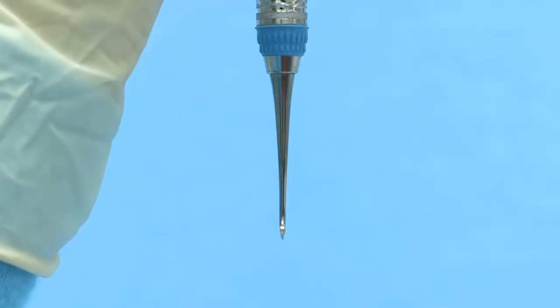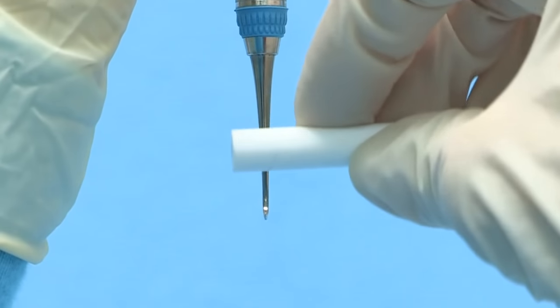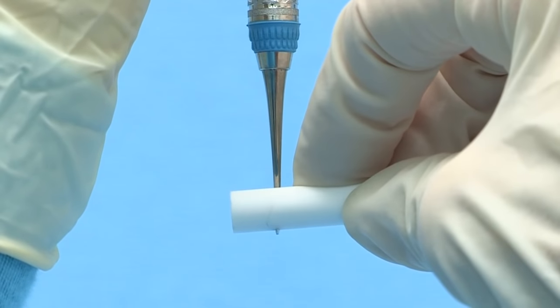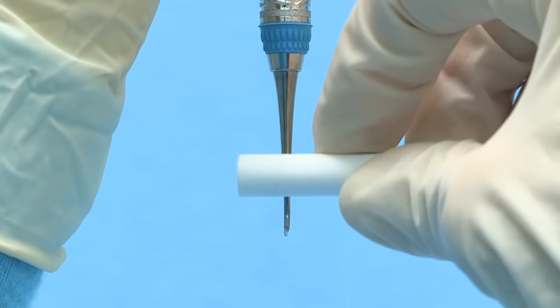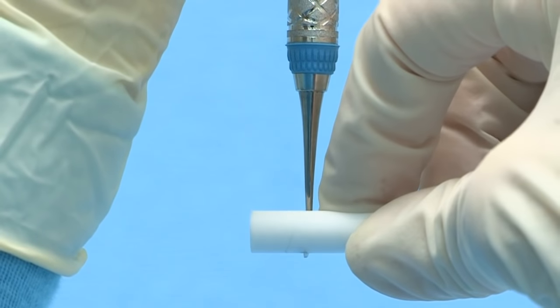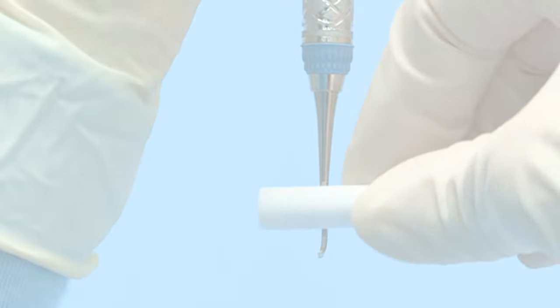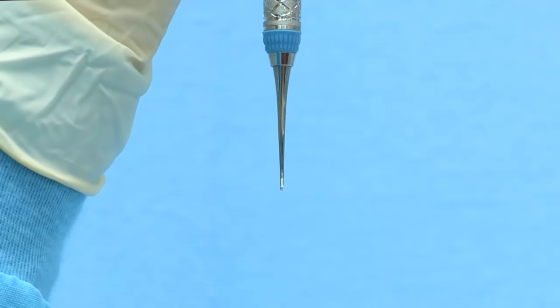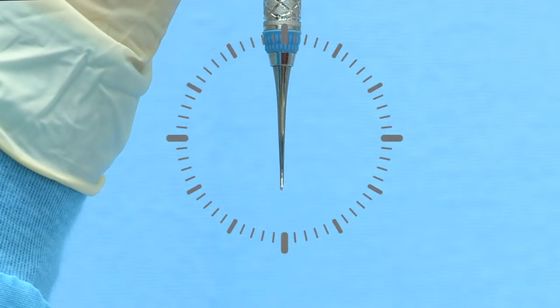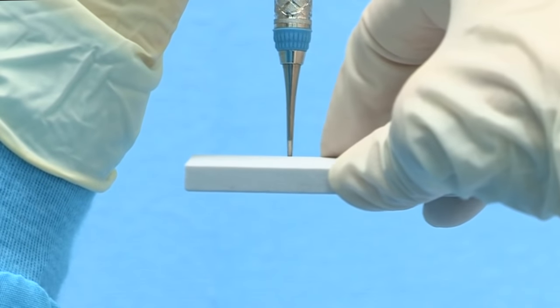To finish sharpening a curved sickle scaler, hold the blade at eye level with the terminal shank positioned at 12 o'clock. Place a cylindrical stone on the face of the blade with the stone positioned horizontally on the facial surface. Lightly roll the cylindrical stone along the face of the blade from the heel to the tip — this will remove any remaining wire edges. To finish sharpening a jacket scaler, position the instrument with the terminal shank at 12 o'clock and the tip pointed toward you, then lightly move a flat stone from side to side on the facial surface.